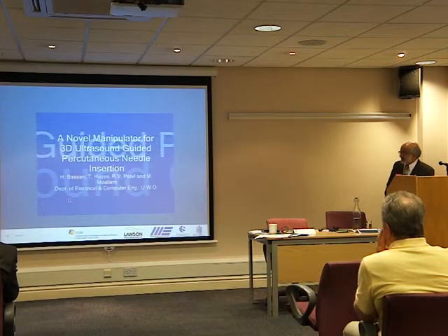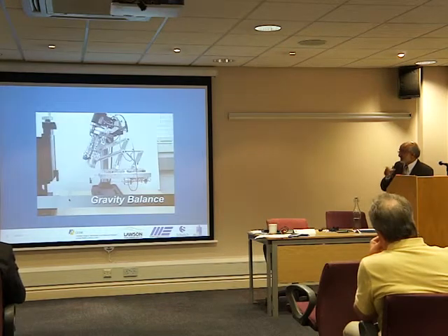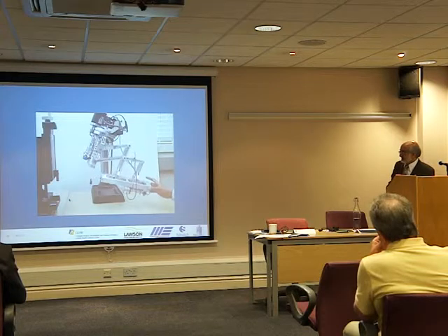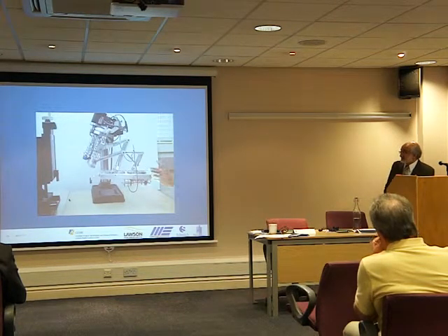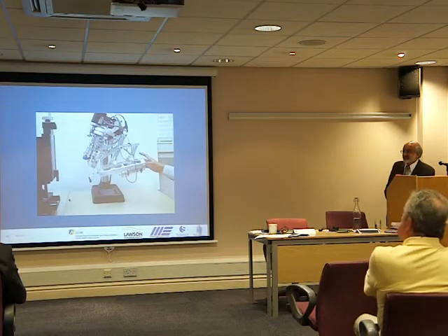This is a video that shows the device and some of its properties. The device is gravity balanced, so that we can position it and move it in any way we want to.